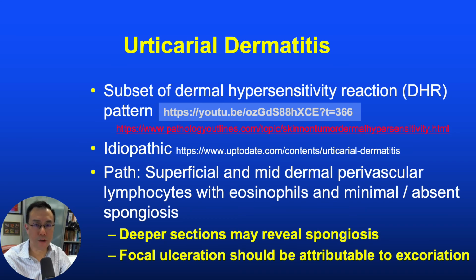As a practical note, I have a low threshold for getting deeper sections when I encounter one of these biopsies. Sometimes deeper sections will reveal quite prominent spongiosis, or sometimes even a different diagnosis like folliculitis, or once I even saw scabies.